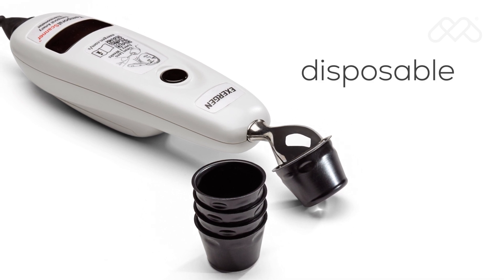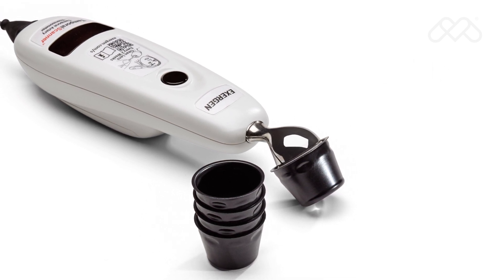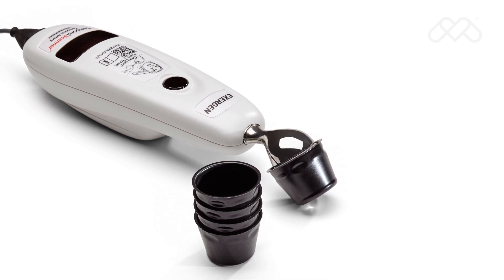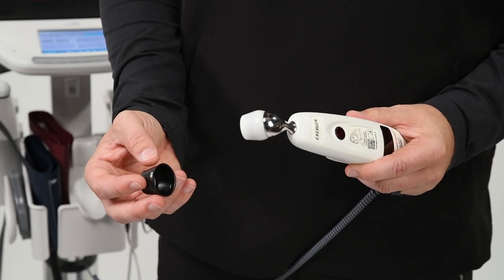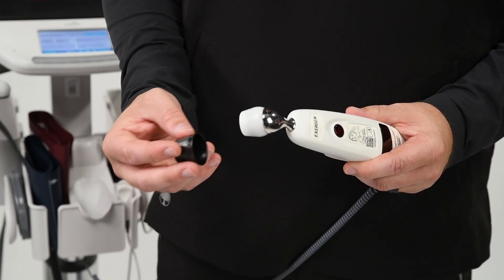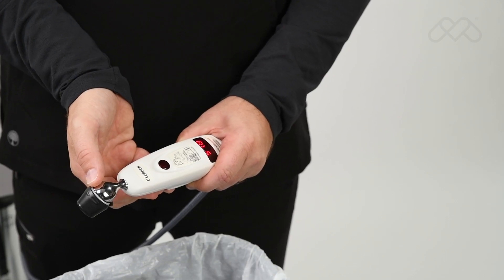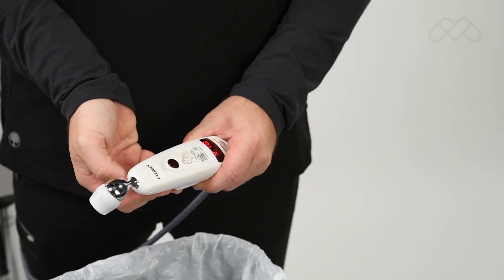Disposable covers can be used once and discarded or reused on the same patient. They are available for cross-contamination protection as preferred for certain patient populations. To use the disposable covers, first apply the cover by pushing it onto the probe head with your fingers, then remove the cover by pushing the edge forward with your thumb.